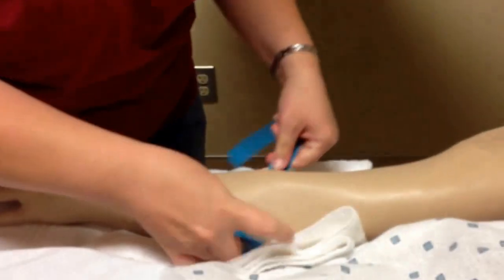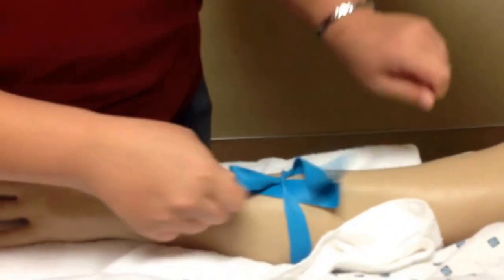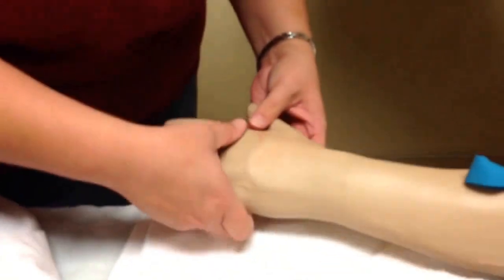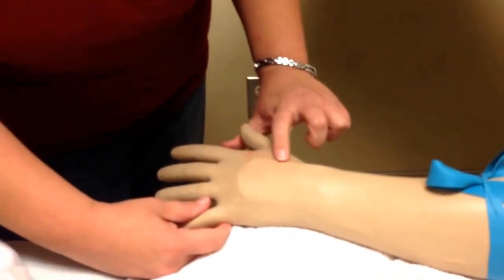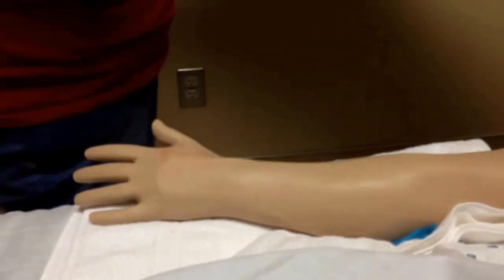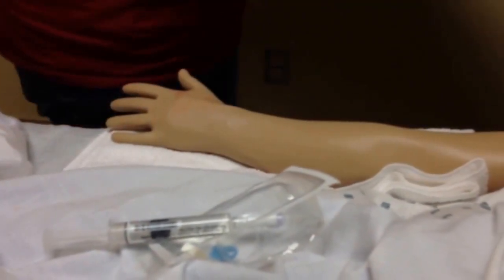I'll apply my tourniquet and visualize the vein. You always want to put your tourniquet above the site you're going to stick, and you want to start as distally as possible — starting with the hand. I'll have the patient hang their hand down and make a fist, then palpate the vein. That's a good vein — soft and spongy. I'll release my tourniquet because I don't want it on for long periods. I'll make sure all my supplies are ready and position my saline lock and tape close to me.